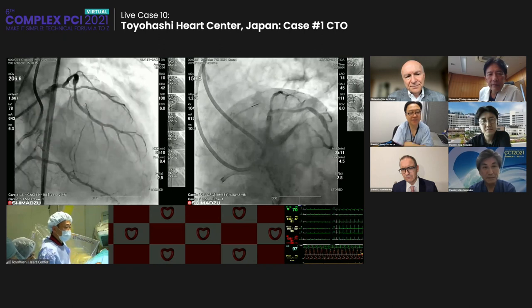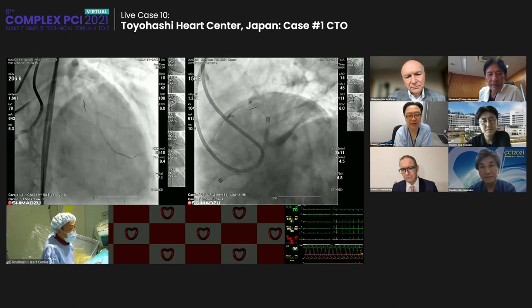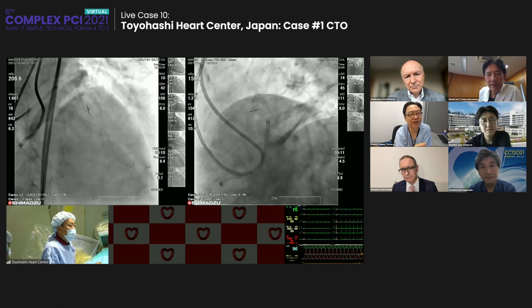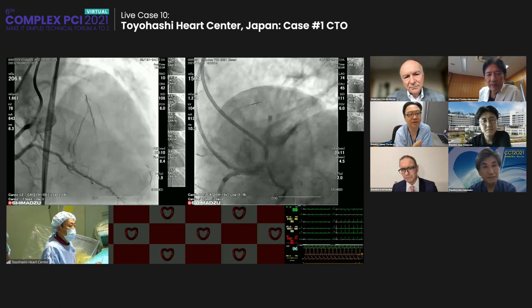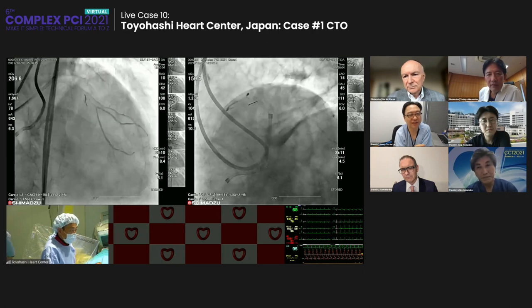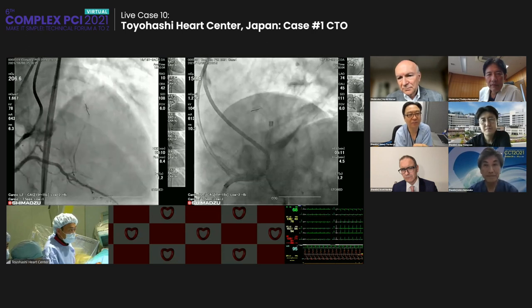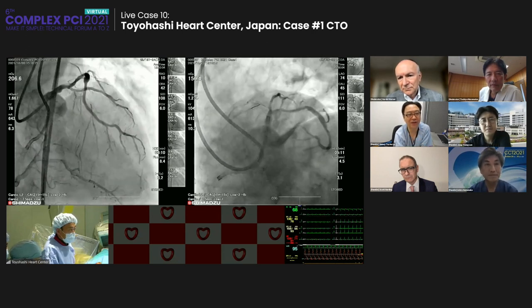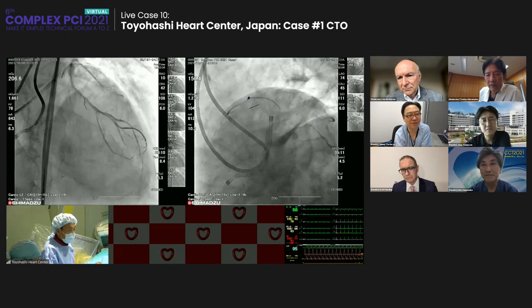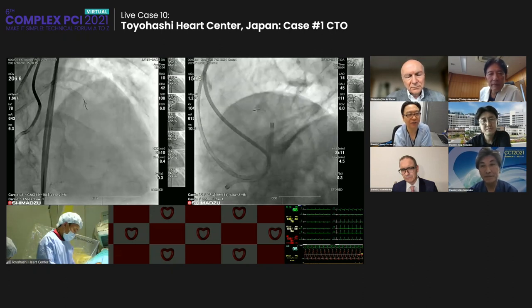I think that sometimes on X-ray, you can use a Shimadzu clear stent or stent boost way to look at the stent and see where your wire is. Sometimes that helps a little bit to see if you are in the stent lumen, because it's clearer. But of course, you need a two-marker system, and a dual lumen catheter may be useful for that purpose, positioning in the stent and seeing where your wire is. That may be helpful for the antegrade wiring part.